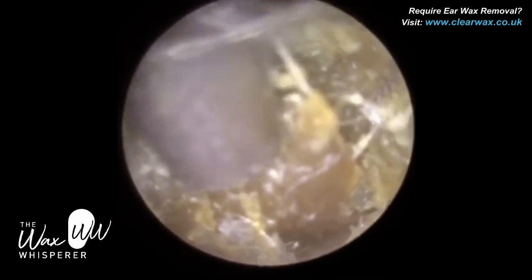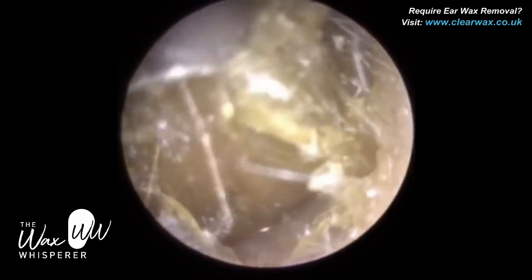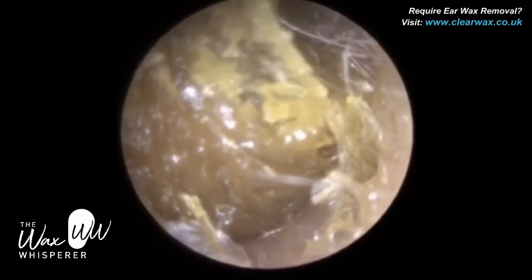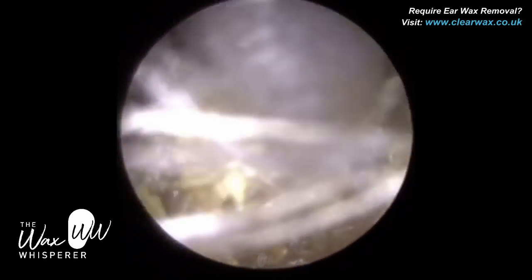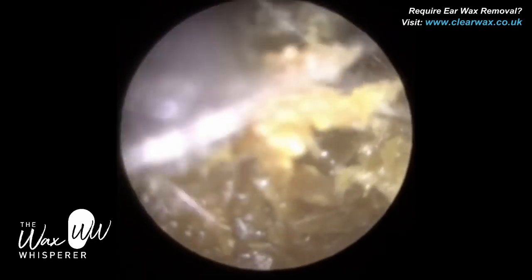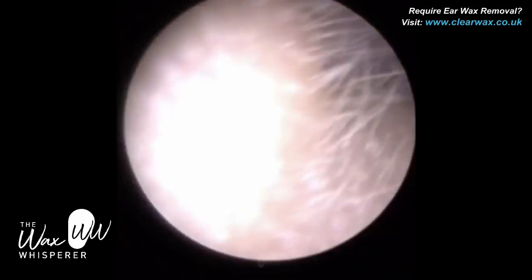This is why an endoscopic approach is so good — it gives us a panoramic view of the entire ear canal. We can quite easily see where the wax is attached to the canal wall, whether it be the posterior canal wall (the back part), the anterior canal wall (the front part), the superior canal wall (the roof), or the inferior canal wall (the base of the ear canal).